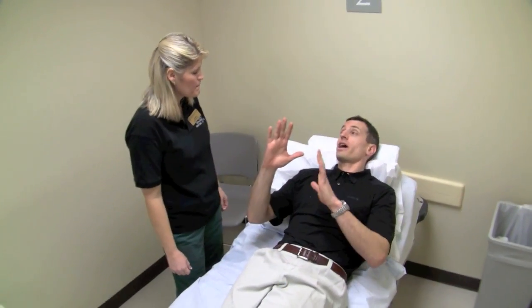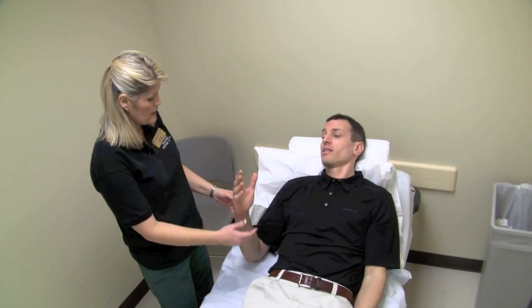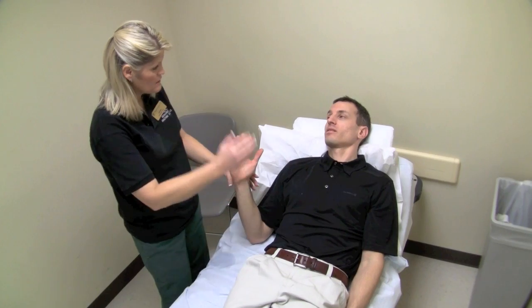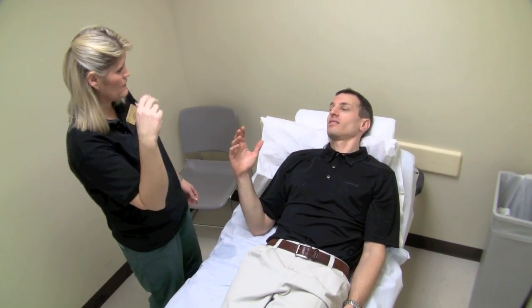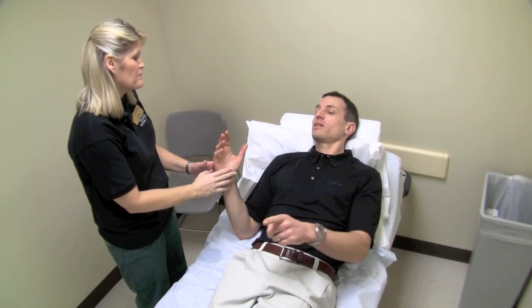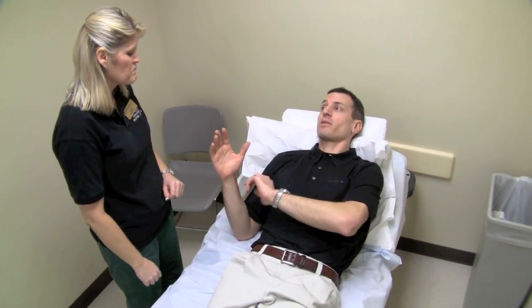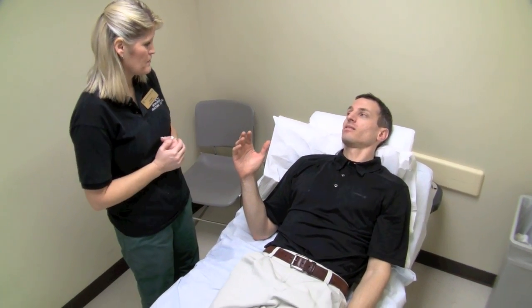For the ulnar gutter splint, do you have them lying on their back when you put it on? I do — a lot of times it's just easier; all they have to do is relax rather than trying to be gumby and move around. For the thumb spica I was sitting up — do you usually have them lying back for that too? I actually usually have people sit up for thumb spicas.